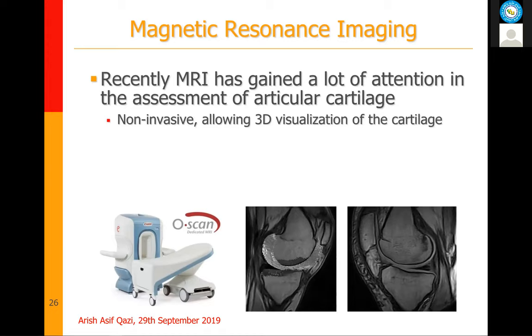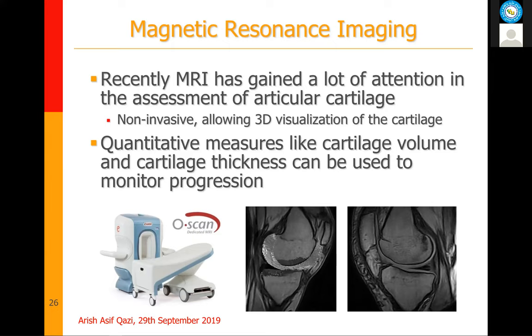You can develop algorithms that can automatically segment the cartilage, like the one shown over here. Based on the segmentation of the cartilage, you can generate quantitative measures like cartilage volume and thickness, which can then be used to monitor the progression of osteoarthritis.